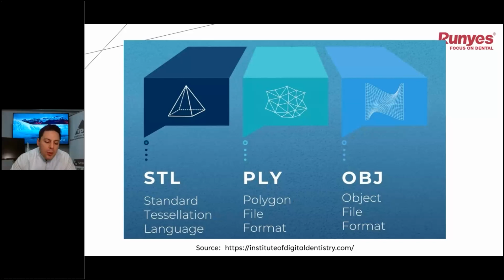For example, programs that make aligners, or programs where you have to import the STL file. Almost all of them use STL files for sure.